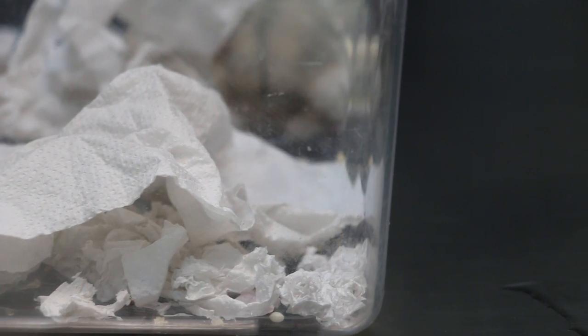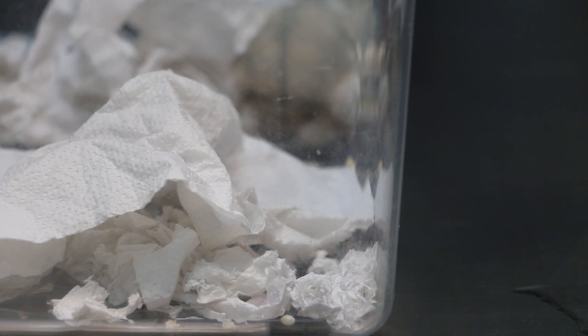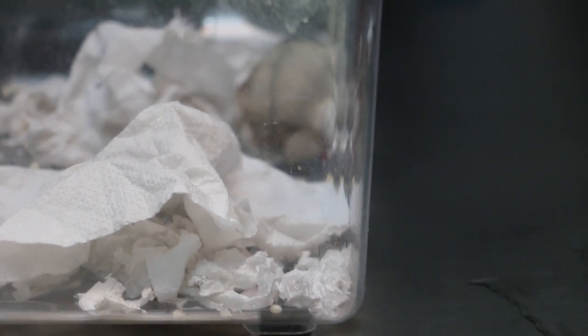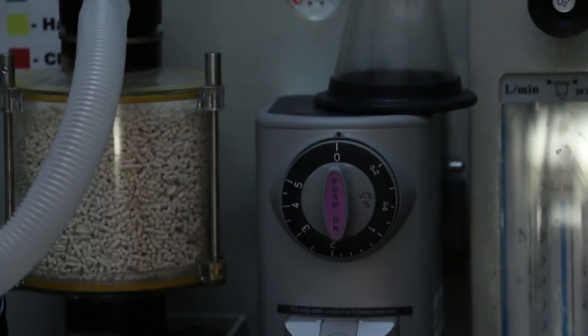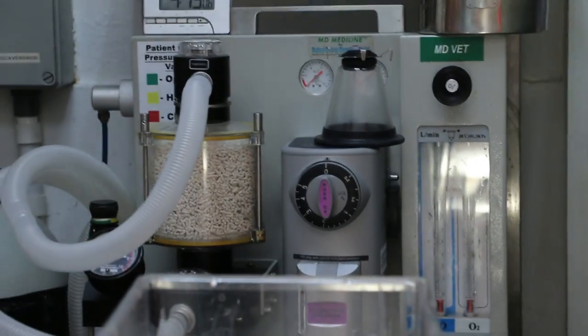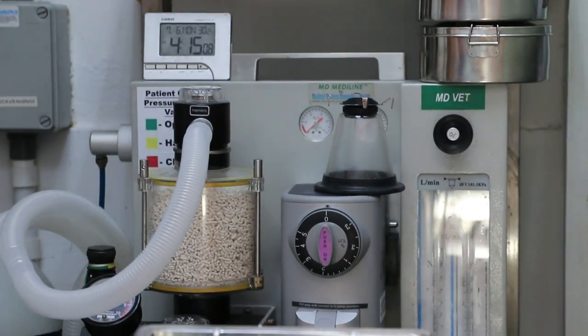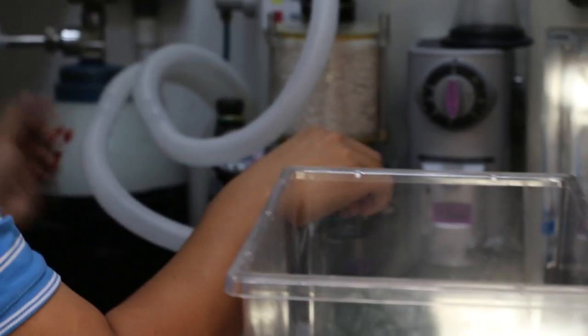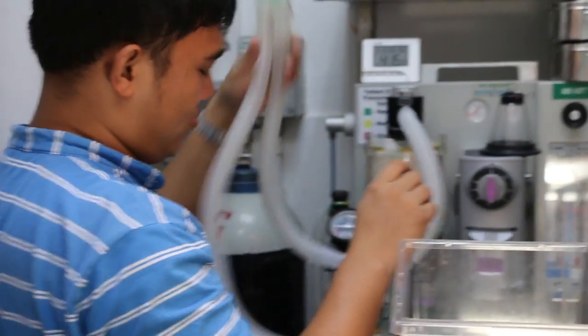A small one also. You can see the wart there. The right hand leg, yeah. About 5 mm times 3 mm. The anaesthetic gas is ready. Isoflurane plus oxygen if necessary. We prepare first.